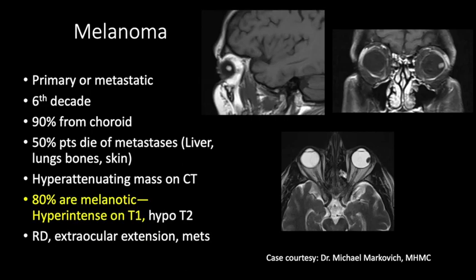Melanoma may be primary or metastatic, commonly seen in the sixth decade. 90% of melanomas arise from the choroid, and 50% of patients die of metastatic disease usually to the liver, lungs, bones, or skin. They present as hyperattenuating mass on CT scan. 80% of melanomas are melanotic, therefore hyperintense on T1. Here we see a mass hyperintense on pre-contrast T1-weighted images because of melanotic melanoma, with low signal intensity on T2. We should look for extraocular extension and metastasis.